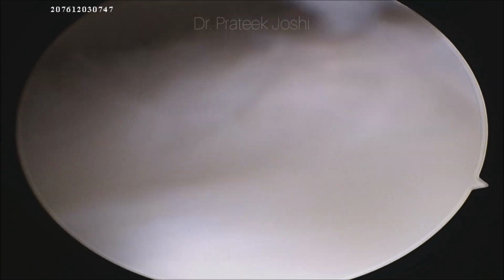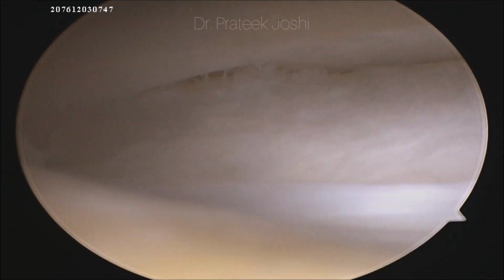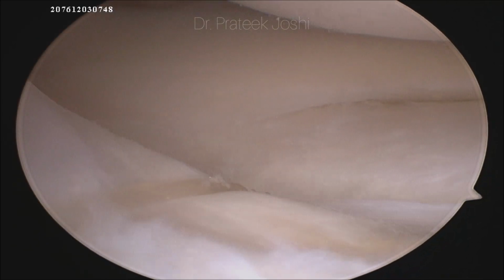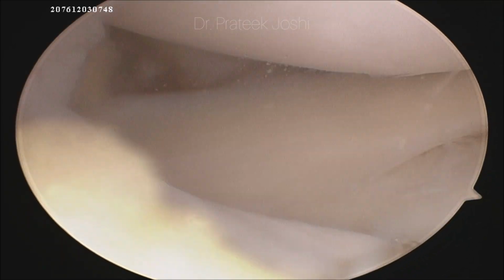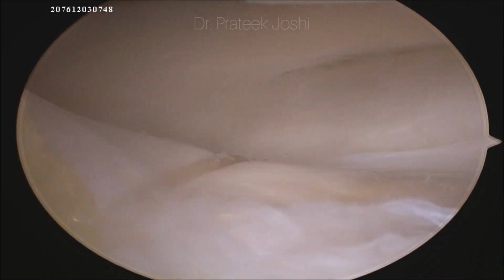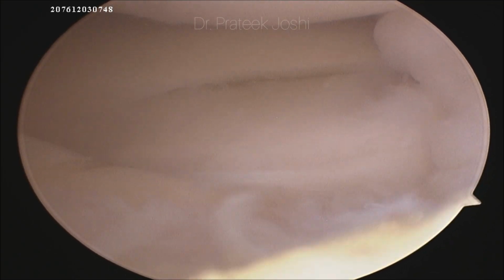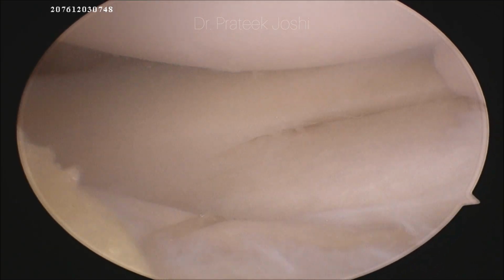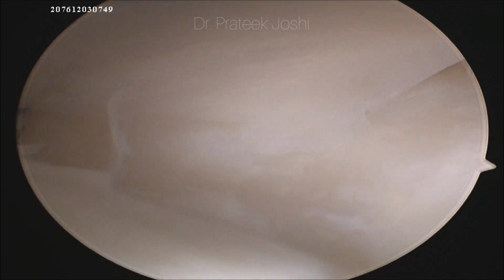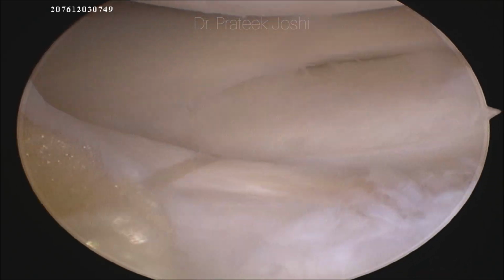So this is the final picture after the repair of the meniscus tear. Now you can clearly see that the anterior horn and the body portion of the meniscus is sitting very nicely adjacent to the capsule. There is no space whatsoever between the capsule and the meniscus. So we could do good repair in this case. We have used 3 outside in sutures and 1 inside out suture, and this is going to have good healing potential and good results for this patient in long term.